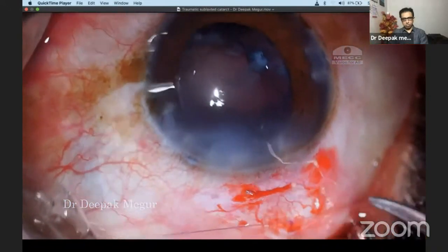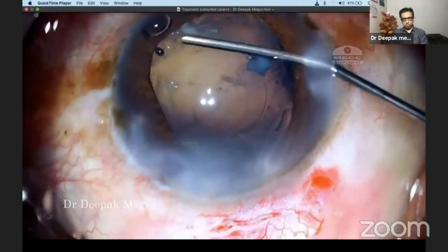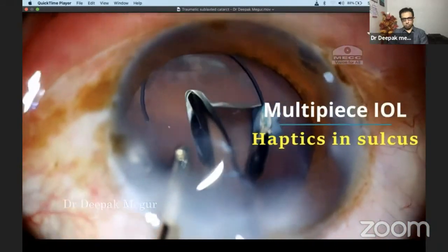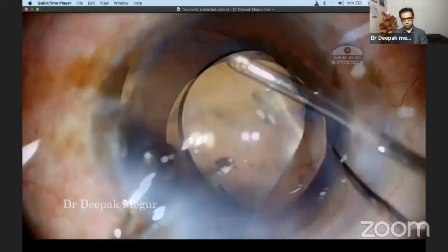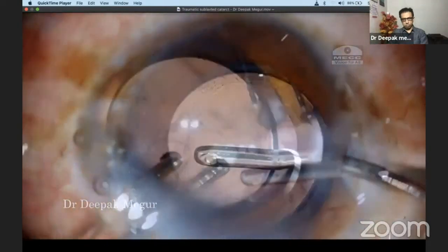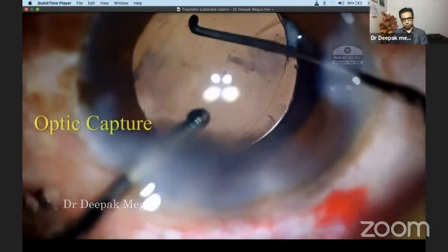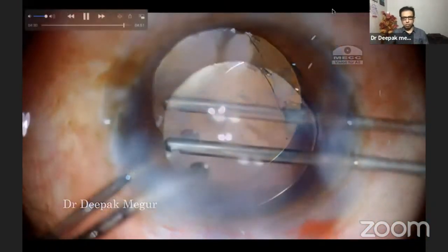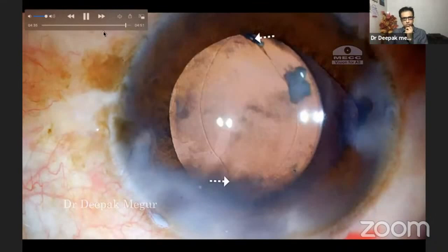I'm closing my sclerotomy using a Z-suture. Now is the time to implant the lens, using sodium hyaluronate to create some space. The plan is to implant a multi-piece lens with the haptic in the sulcus and then trap the lens behind the rhexis margin to achieve optic capture. It's important to go back behind the lens and remove the OVD used. Once the sodium hyaluronate is removed, we tuck the lens back posteriorly. You can see there is some vitreous again prolapsing through that area, so I use my vitrector. The ovalization of the rhexis confirms the optic capture.